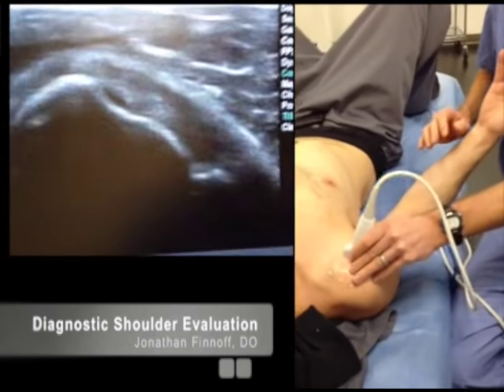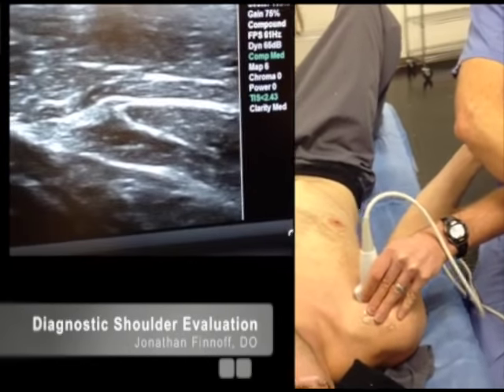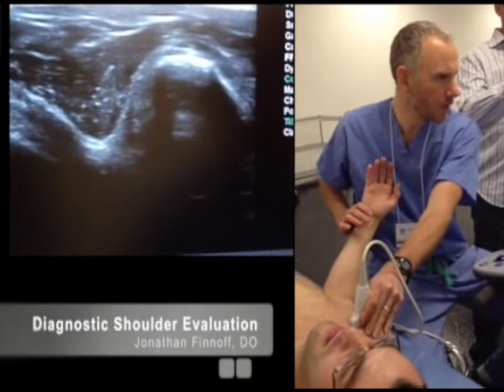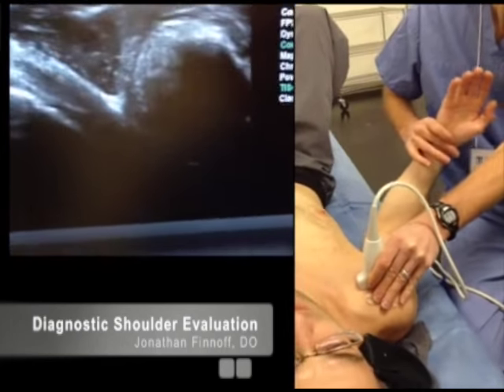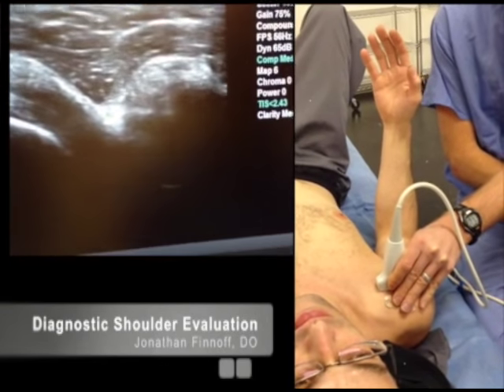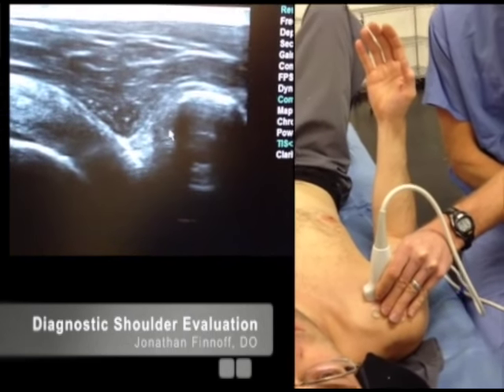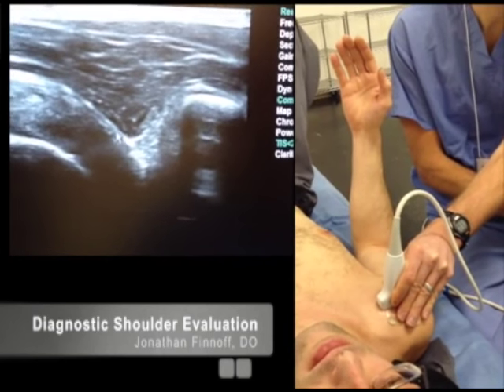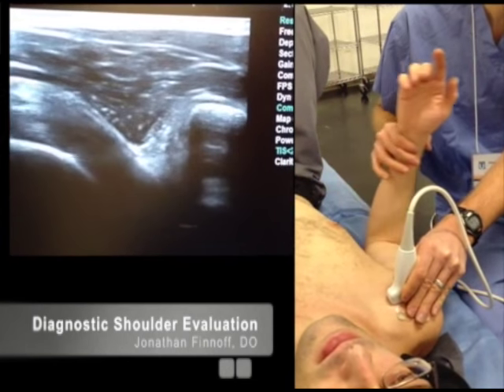After looking at the subscapularis, I like to move a little bit more medial and increase depth. Right here is the coracoid process. You can internally and externally rotate the arm while looking at the subcoracoid bursa, which sits just superficial to the subscapularis — between the coracoid process and the subscapularis. As you internally and externally rotate, look for bunching and thickening of tissue in that area.